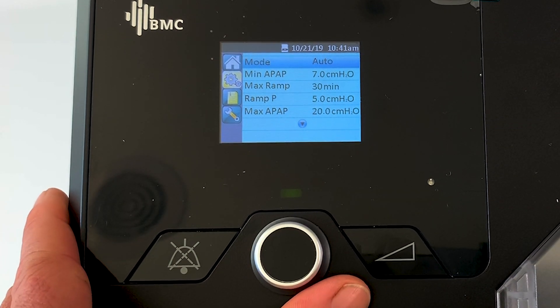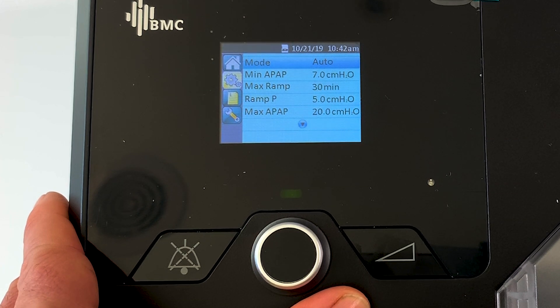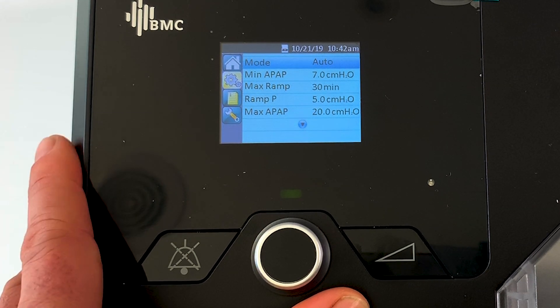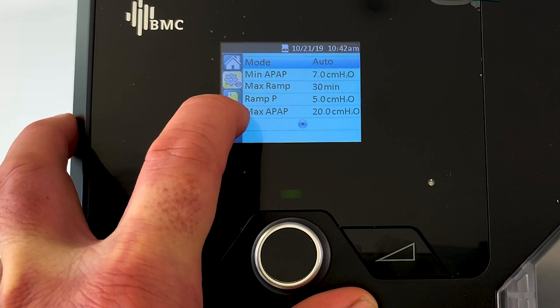The next four things down from there are: the minimum auto pressure (min APAP), the maximum ramp setting, the ramp pressure, and the max auto (max APAP) pressure. It's probably easiest if I just explain how these four menu items relate to each other.